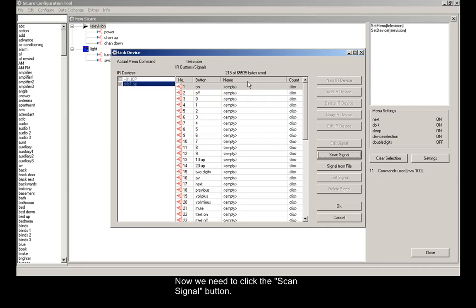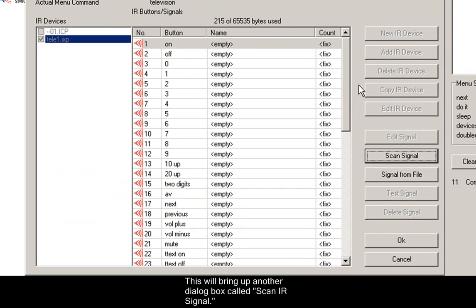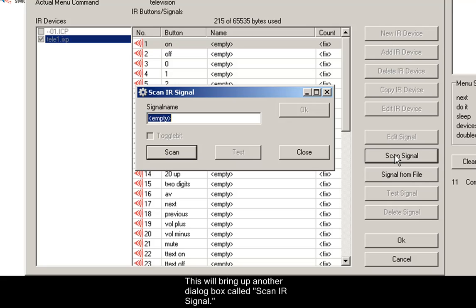Now we need to click the Scan Signal button. This will bring up another dialog box called Scan Infrared Signal. Type in the name of the control you are scanning, in our case, Power. Now click the Scan button and pick up the television remote and point it towards the top of the Sicare.